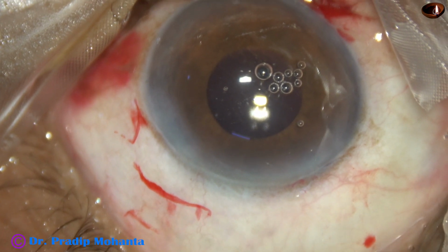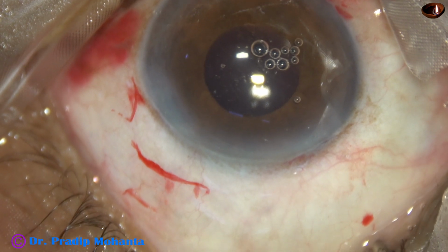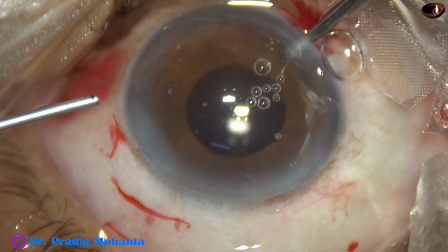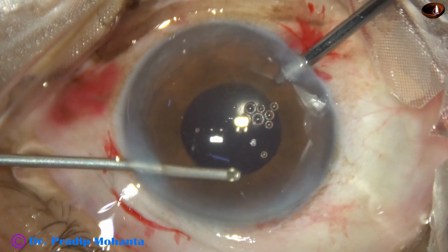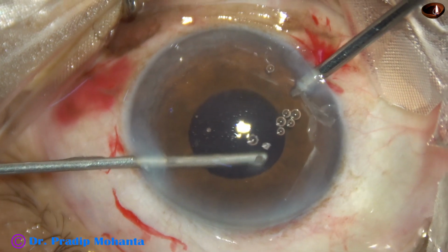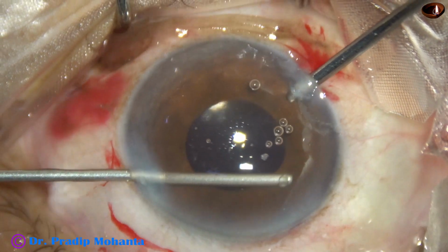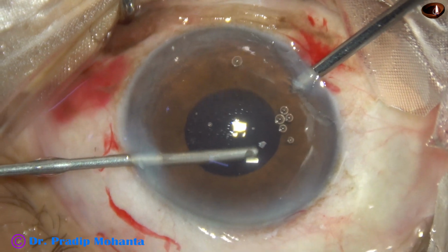So I take the cutter again, irrigation through the right side port and cutter through the left, and here I cut the vitreous strand. And this is the final stages of the surgery.